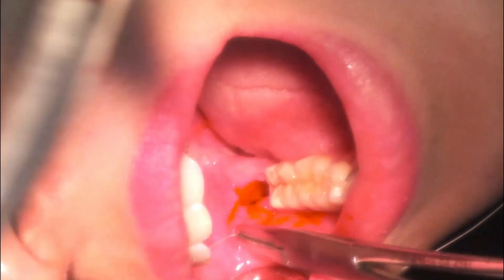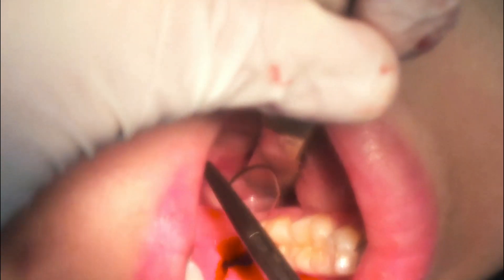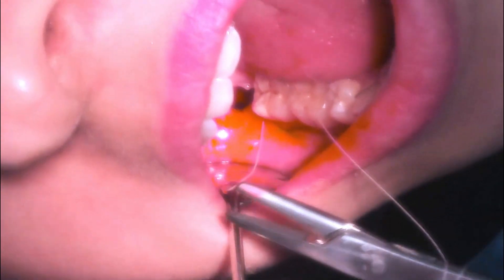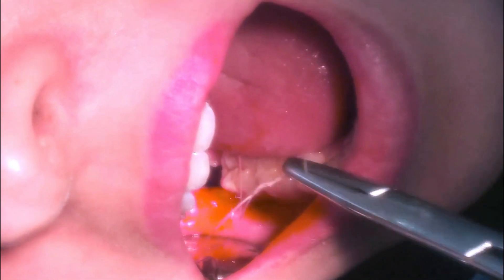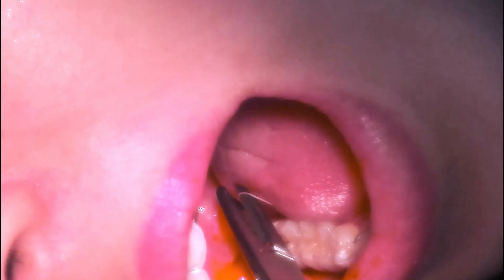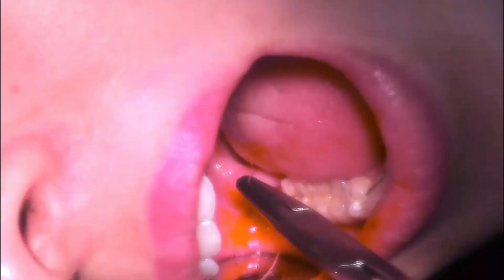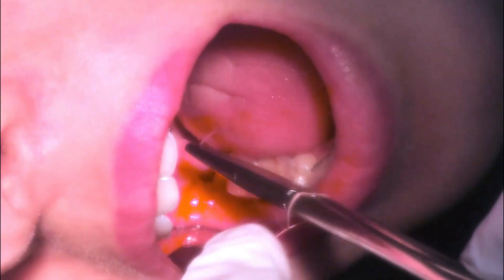The sutures I am using are Vicryl Rapid sutures, so the patient does not need to come back for stitch removal. The number of stitches I usually use for a routine case are about three. This is the key stitch — it should nicely adapt the flap just distal to the second molar to prevent any future food lodgement.